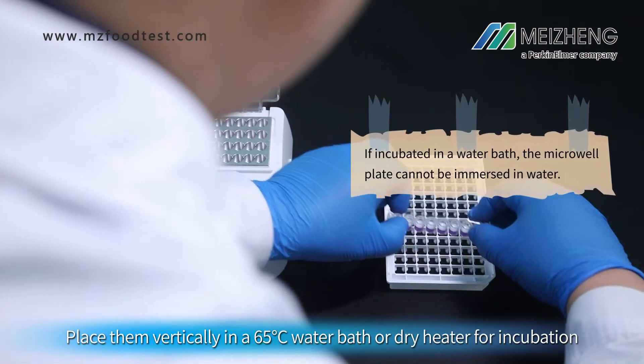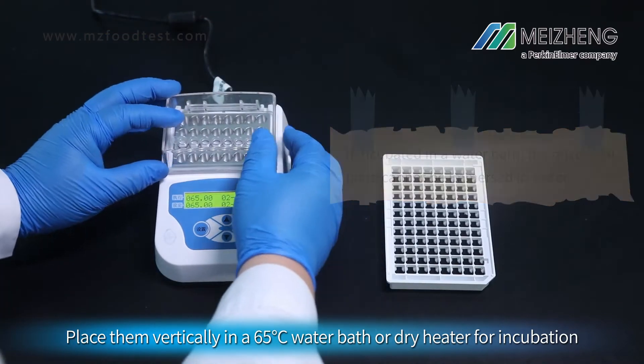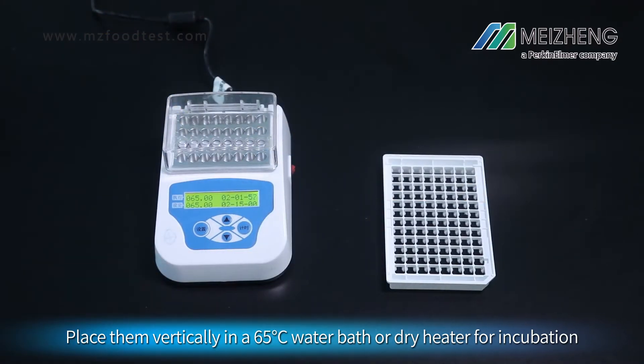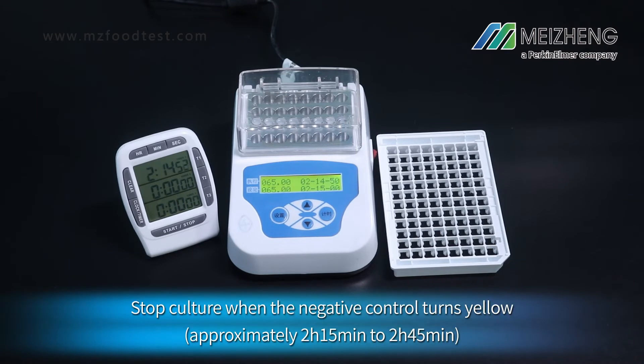Place them vertically in a 65 degree Celsius water bath or dry heater for incubation. Time for 2 hours and 15 minutes. Stop the culture when the negative control turns yellow.